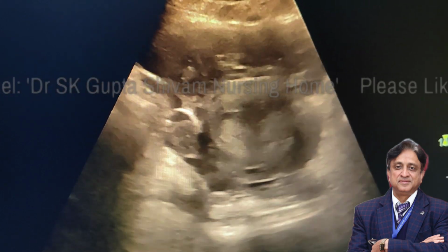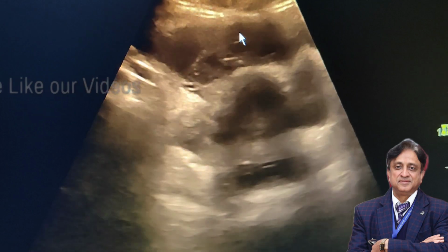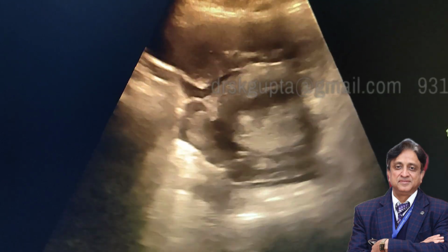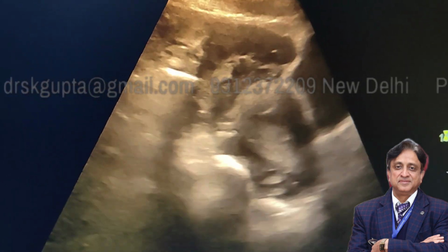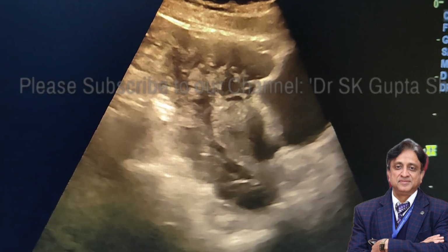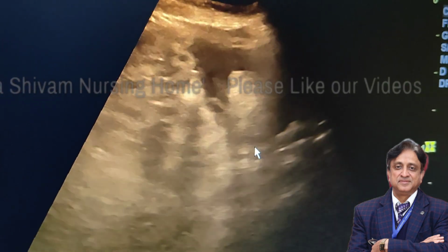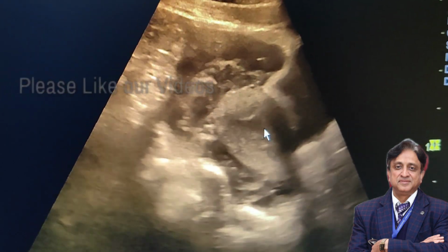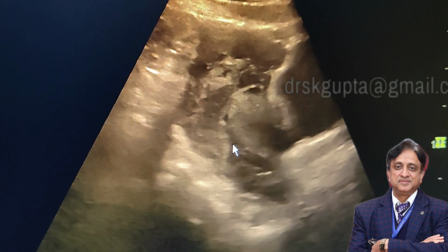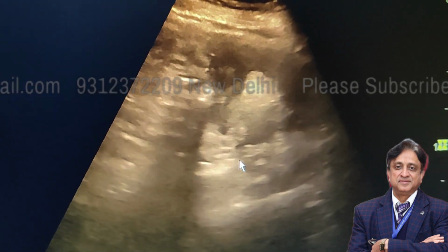And when we see the uterus, we find that this is the uterus and these are probably the ovary, but surrounding the uterus there is some complex fluid, and this complex fluid is nothing but clot of the blood around the uterus and the periuterine tissue. We cannot actually differentiate the ovaries, but we can see that this is the uterus and the uterine cavity appears to be empty. You can see that the uterine cavity appears to be empty, and there is a complex fluid around the uterus which suggests that probably this patient had ectopic pregnancy which has now ruptured.